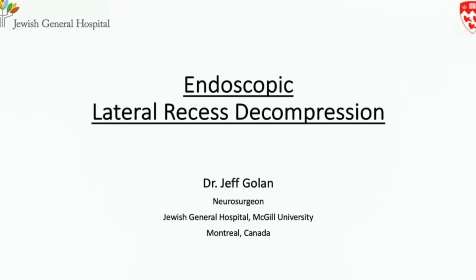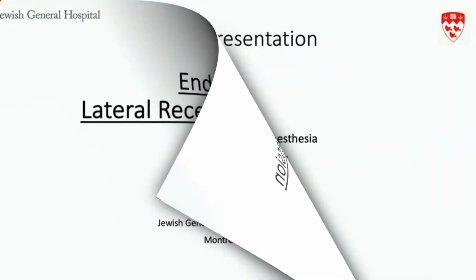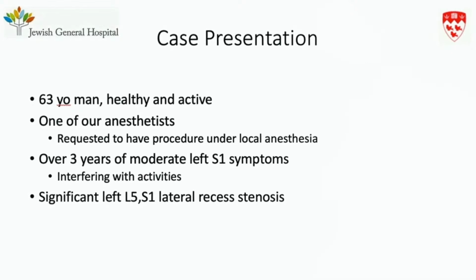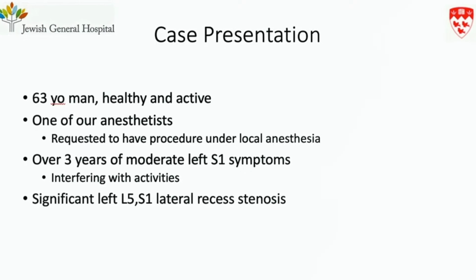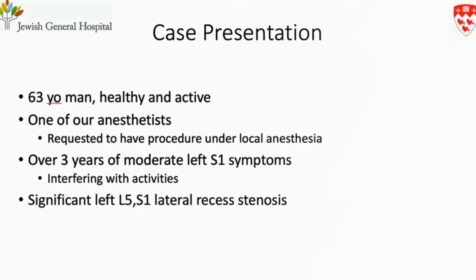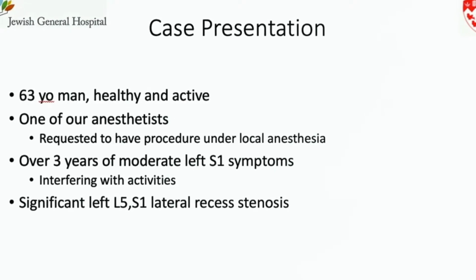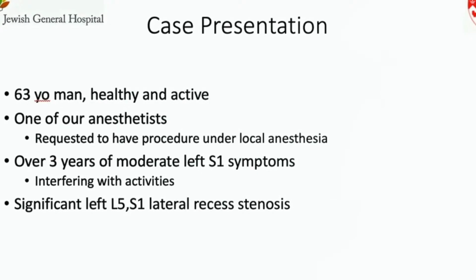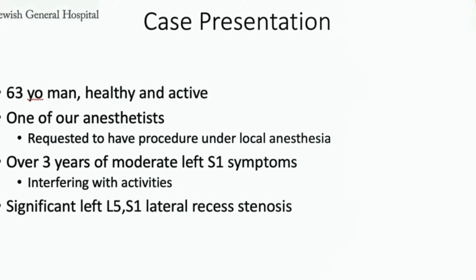An endoscopic lateral recess decompression that I recently performed. The patient is a 63-year-old active and healthy gentleman who is one of our anesthetists and requested to have the procedure under local anesthesia. He's had sciatica for about 3 years, and the MRI revealed a significant left L5-S1 lateral recess stenosis.